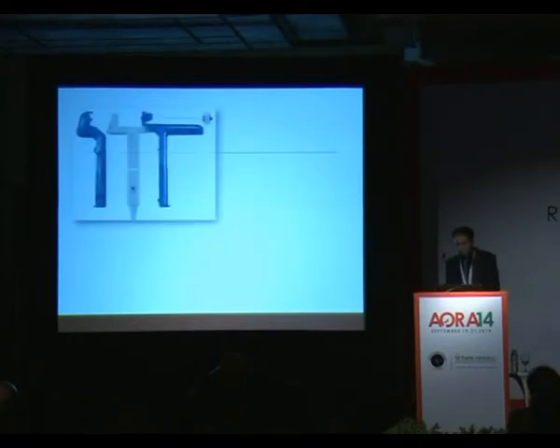And this is overlaid onto the ultrasound image. So the components are a little different. You have a rather oddly shaped probe here. It's not your typical probe: this is the handle, and this is the footprint of the probe. The blue structures you see are actually reusable probe covers, which you can use to maintain sterility. And the needle incorporates a magnet. You see that round thing there? The needle incorporates a magnet which goes through the bracket.